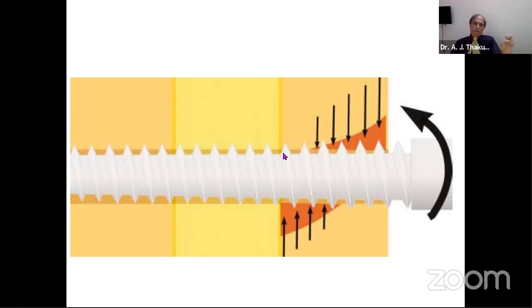Whatever wonderful fit we produce by using the exact pilot hole and the latest threaded interference screw, still the health of the bone is of paramount importance. If the bone is fragile, like in osteoporosis, when the patient takes weight and there is loading on that, it will give way. The screw will be intact, it will work very well, but the bone will reach its tolerance of resisting this kind of load, will break down, and the pin will loosen. So getting the best interference fit is not a certificate or a license to walk without restrictions.